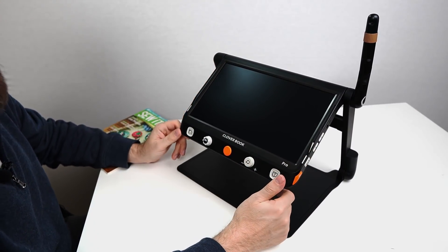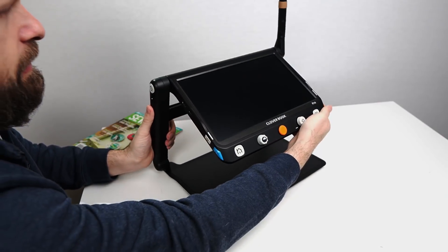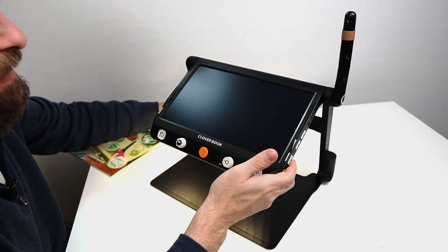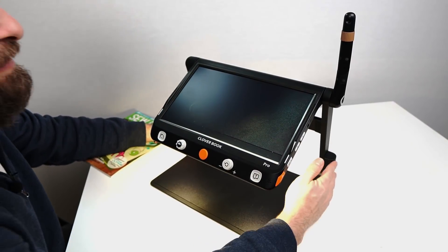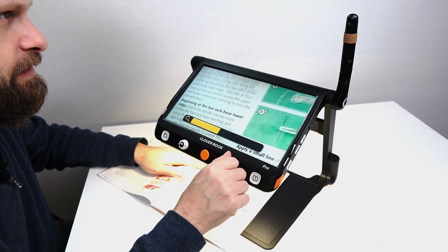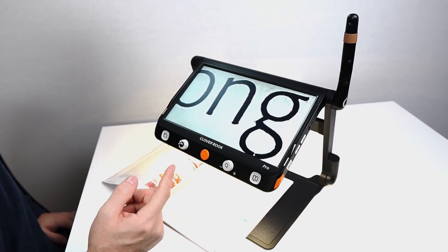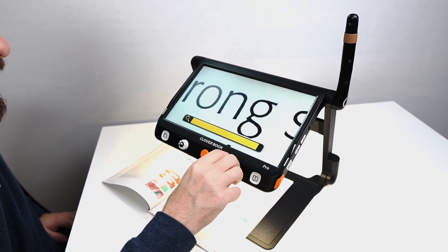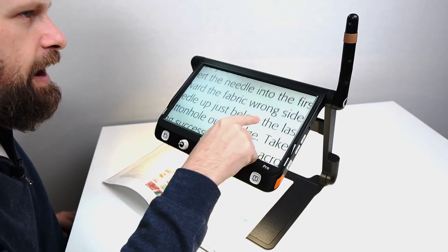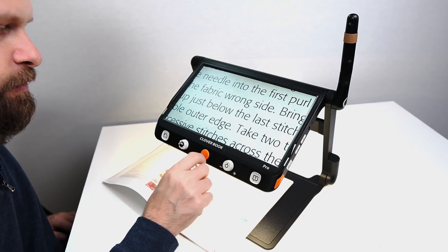Along with the provided HDMI cable, you'll be able to plug this up to a TV or external monitor. To power on, just long-press the power button for a second or two — the button lights up and you get a little sound effect. Using a magazine here: there's a dial that will zoom in and magnify really, really large. This has a 4K camera as well as the 1080p screen. It's also a touch screen, so we can zoom in with the dial or use pinch-to-zoom and one finger to pan the image around.